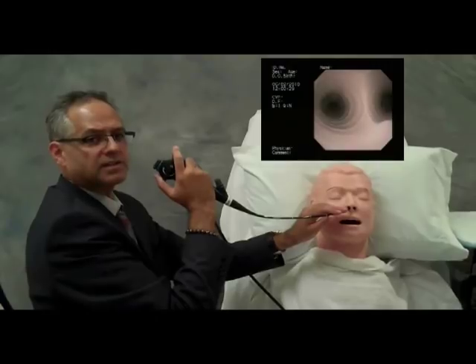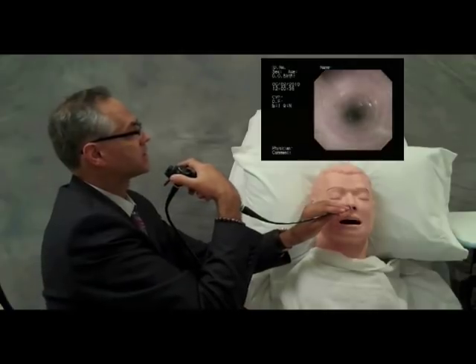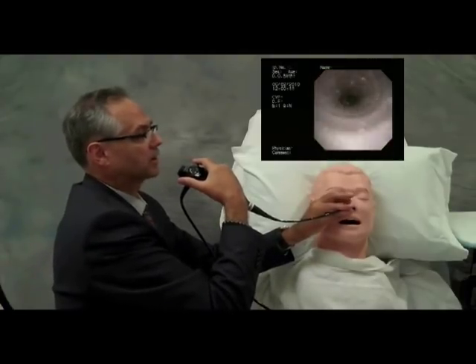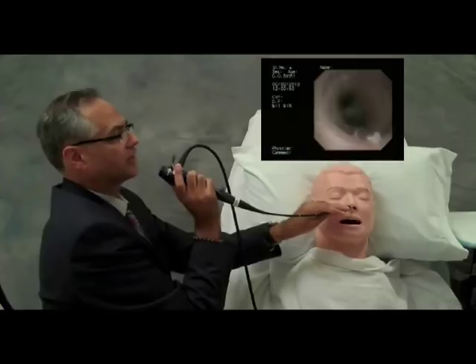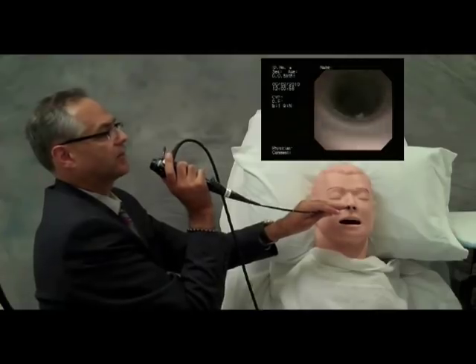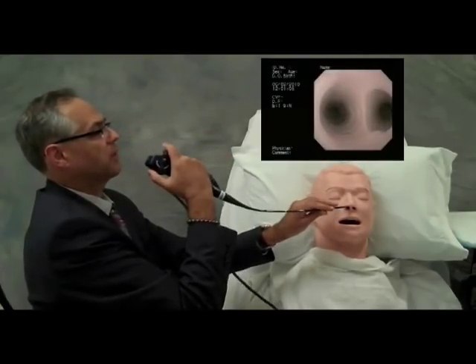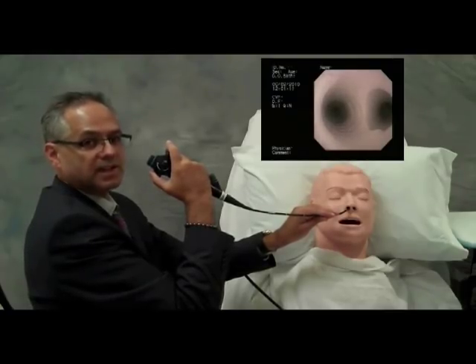The Step 6 exercises take us to the lobar bronchi on both the right side and the left. We move from the right main bronchus to the right upper lobe bronchus, and from the right main bronchus to the right lower lobe bronchus. Rotating the wrist, we move down the left main bronchus to the left upper lobe bronchus, and down the left main bronchus, rotating the wrist slightly to stay in the midline, to the entrance of the left lower lobe bronchus. Notice how we always keep the scope in the midline position — the wrist rotates gently to keep the scope in the center of the airway.